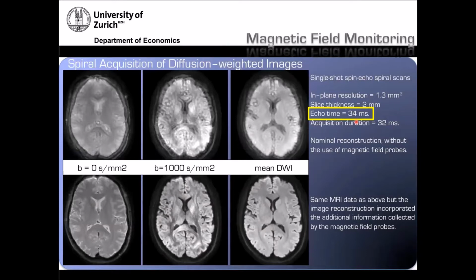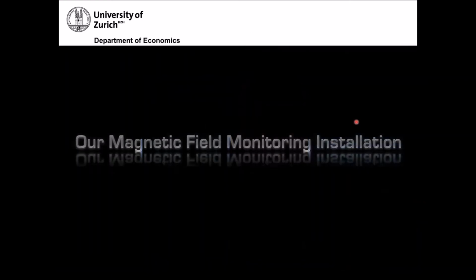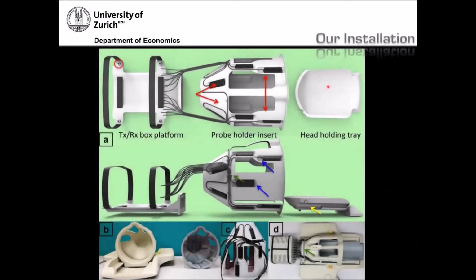And I guess everybody would like to do that if they could. Or at least, even if I can't talk for everyone, I wanted to do this. So based on this sort of hope that I could also do it, we installed our own magnetic field camera. We decided to take these probes that I showed you earlier. These little rectangles house the probes. They're not all the probes themselves. The probes are in there with some electronics.